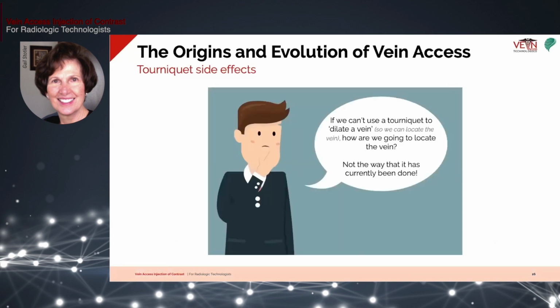So, tourniquet side effects. We can't use that tourniquet then to dilate a vein, to locate the vein. What are we going to do?